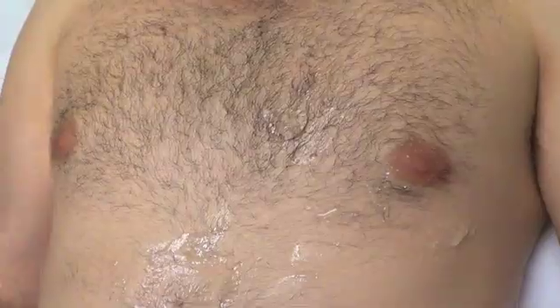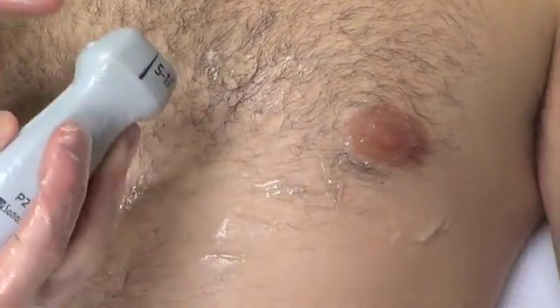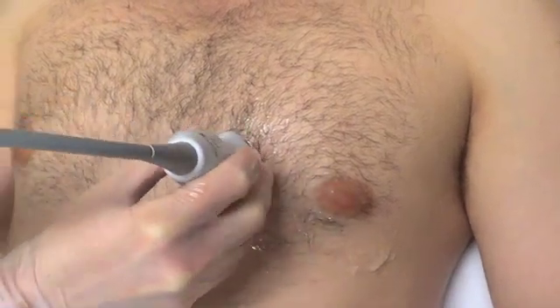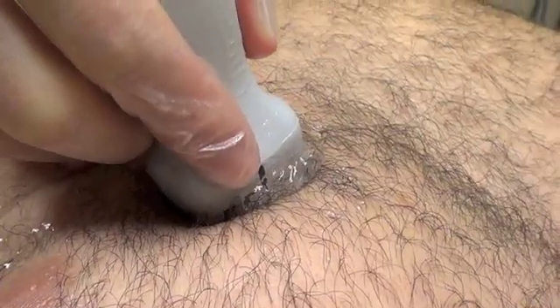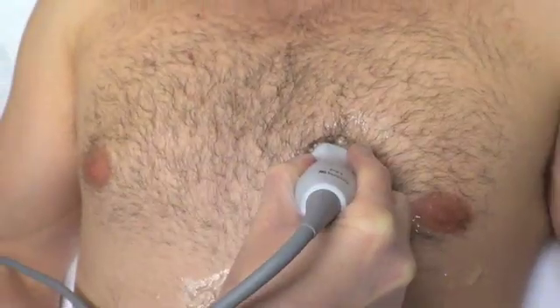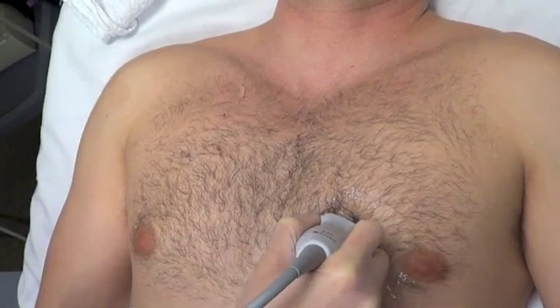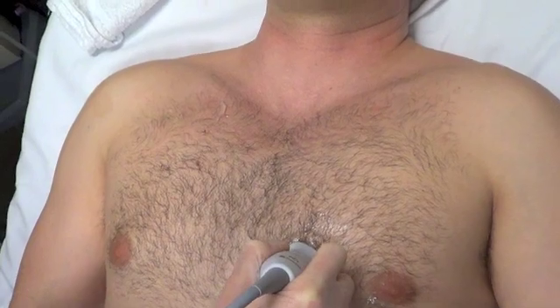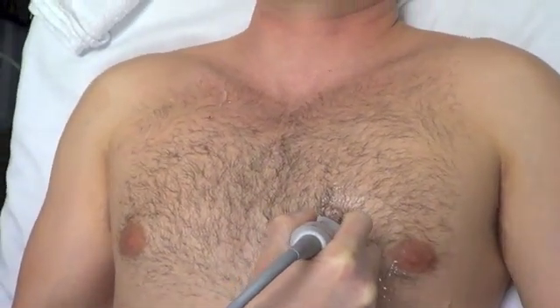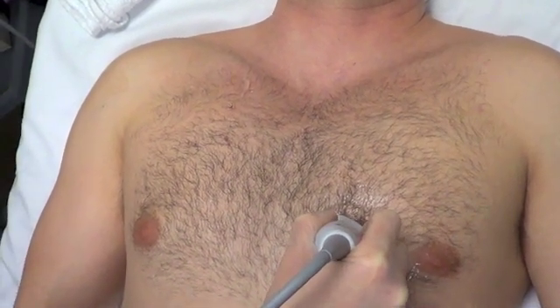We'll move up to the patient's left chest — usually around the nipple line, about the fourth or fifth intercostal space, just to the left of the sternum, with the indicator towards the patient's right shoulder. Keep the probe perpendicular and make sure your depth is adequate so you're not missing anything posteriorly. This is the view we use to look at LV function, assess for pericardial effusions, and look for pleural effusions. You'll see the descending aorta posteriorly — anything above it is pericardial fluid, anything below is pleural fluid.